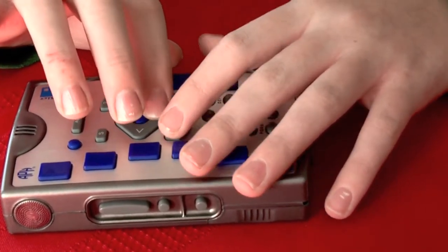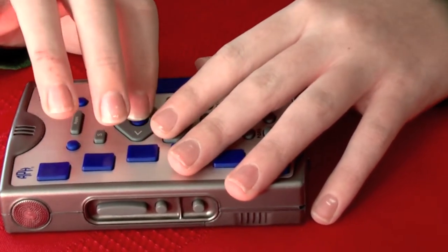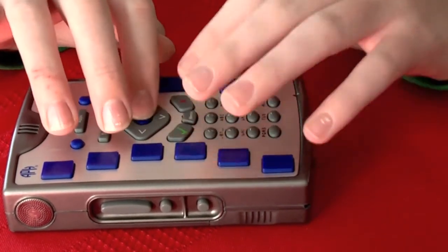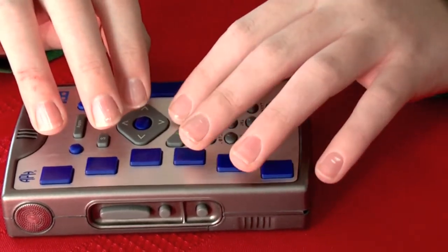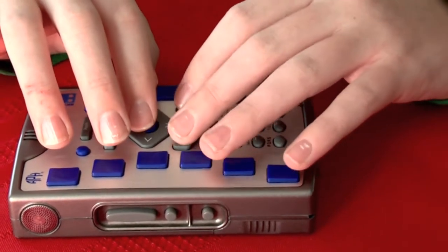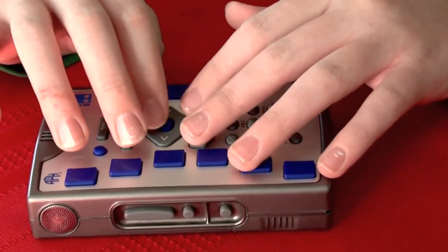I'll hold down arrow to go to the bottom of the list and skip all the other settings — Retrieve Time from the Internet. I'll press select on Retrieve Time from the Internet. You can hear synchronizing and okay. Now it's set correctly: 11:35 a.m. on Tuesday, December 28th.